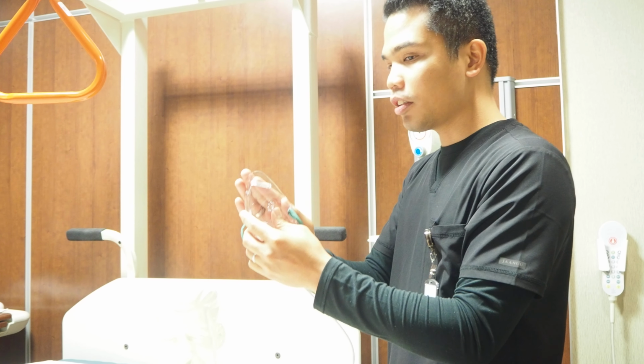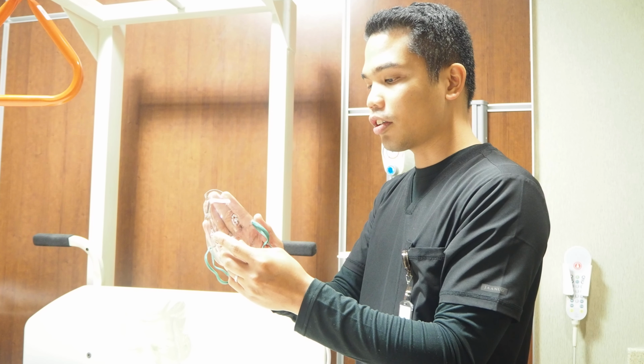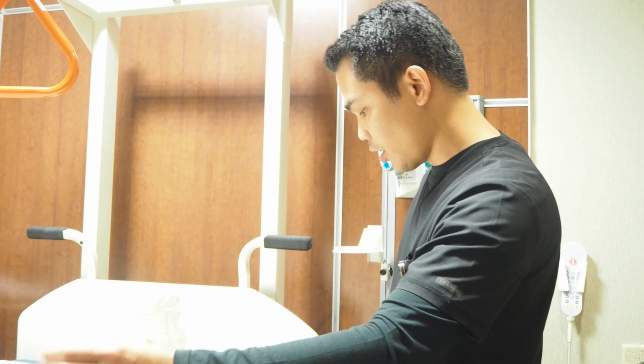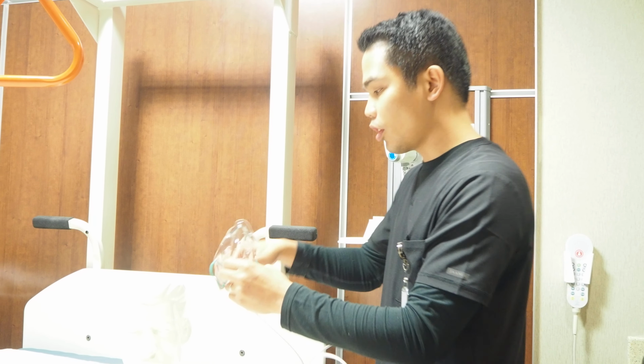So with a simple mask, make sure you feel it with your fingers or your hand if there is adequate oxygen or air coming out. So once you feel it, make sure that the tubings no longer kink, and then hook it up to the patient.